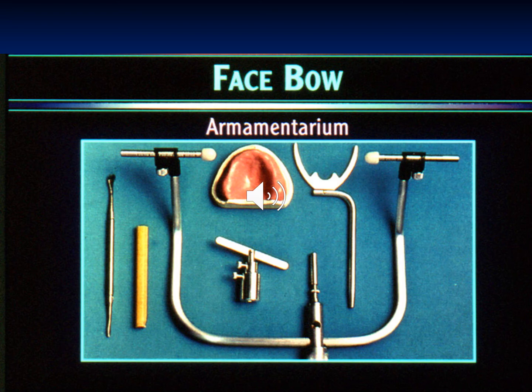Okay, and when we do that, then the mandibular arch is going to be related to the maxillary, and therefore it's going to be indirectly related to the temporomandibular joints inside the patient's mouth, and in a relation that will be transferred to the articulator in an effort to reproduce mandibular movements with high degree of accuracy.